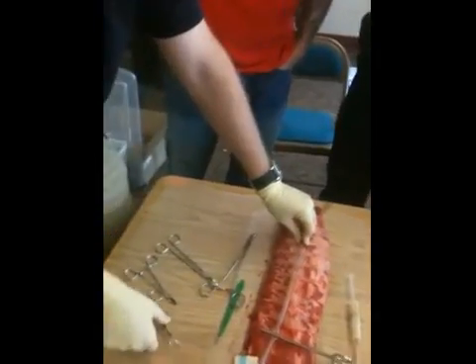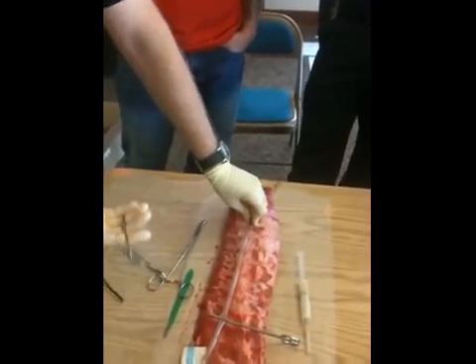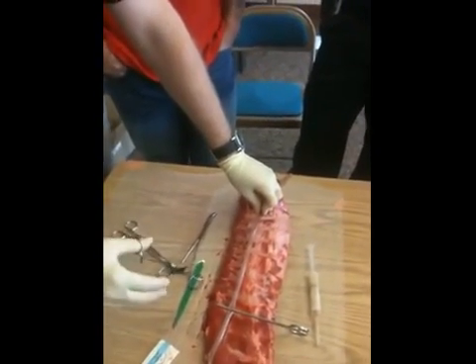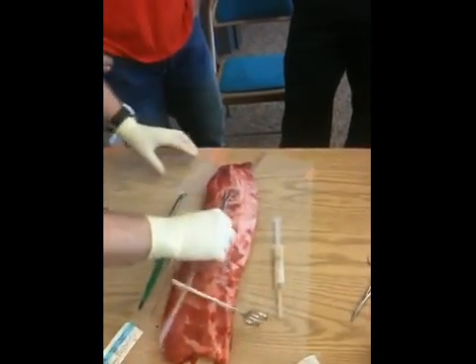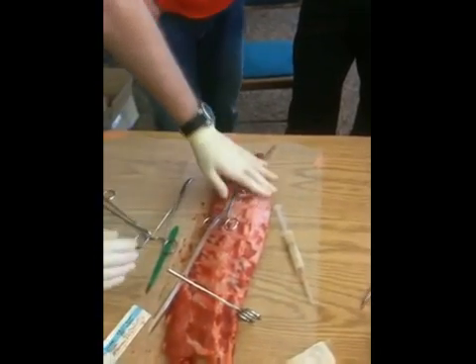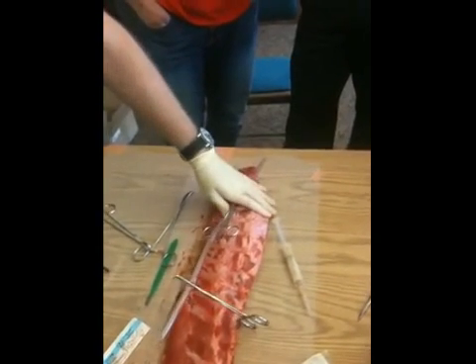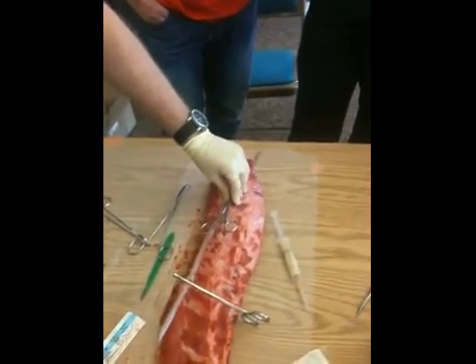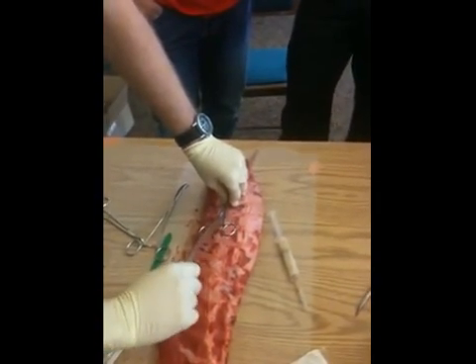We go ahead and look at securing it. A quick down-and-dirty way of securing is to use your towel clamp — it actually works reasonably well. But if you use this, you've got to let people know you're using a clamp, because you'll have some very unhappy trauma surgeons. You just go around the skin and clamp it in place. Then you put an occlusive dressing — there's the whole argument about petrolatum gauze or not. You want a good bulky dressing to secure it. If you get a lot of leakage around the site, go with occlusive dressing. Then hook it up to a Pleuravac — we'll bring one in next week.